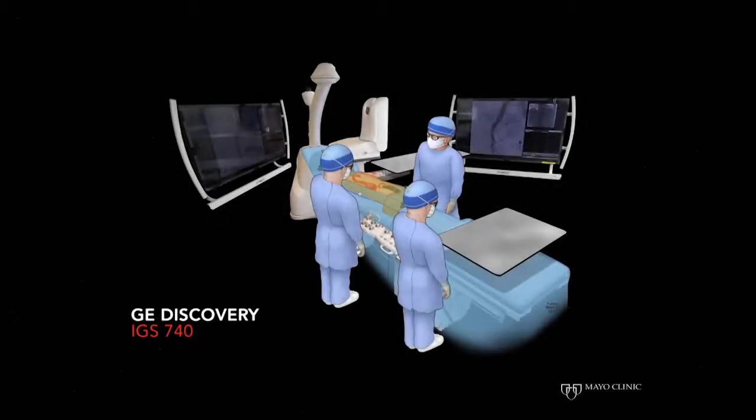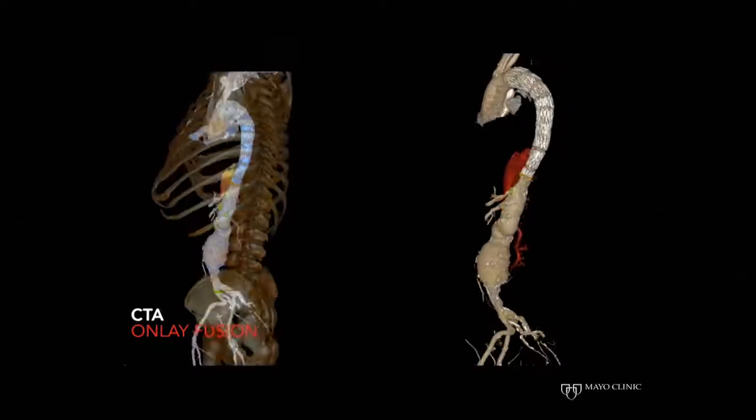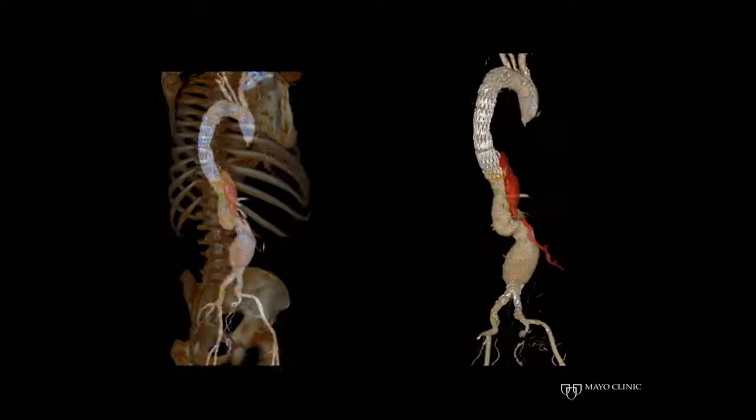This is a video of the actual case. The procedure was done in our GE Discovery IGS 740. We use onlay fusion, which was prepared just immediately prior to the procedure as depicted here.